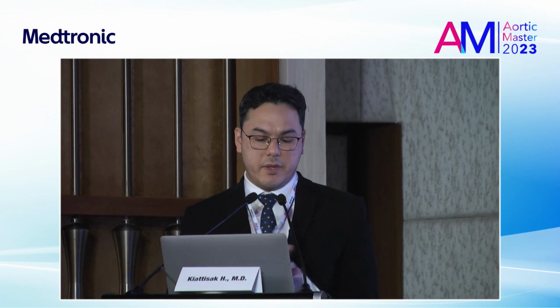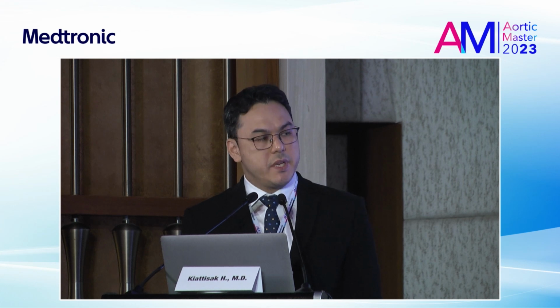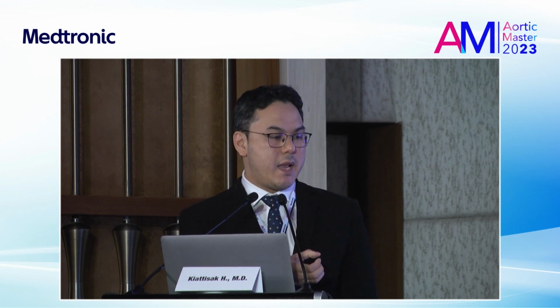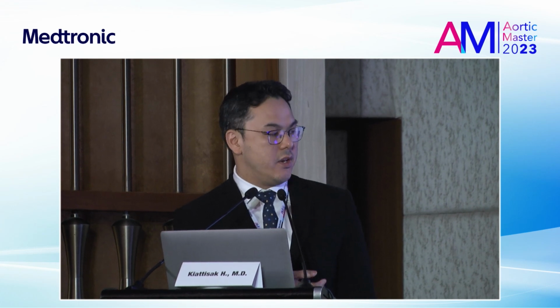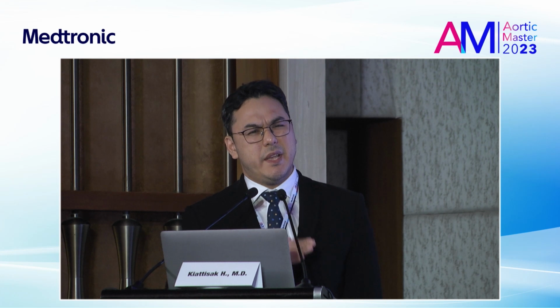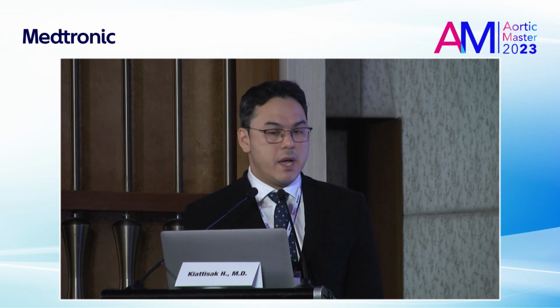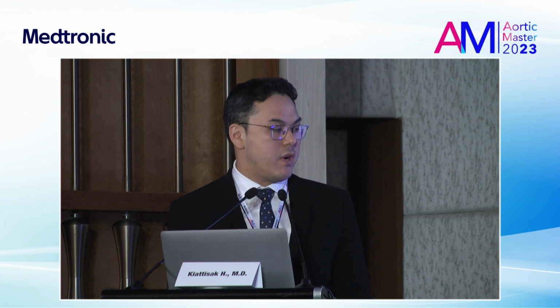I think when you face endotension, and most of them are hidden endoleaks, you have to look at everything for the patient. You have to look at the configuration of the stent, because sometimes it expands and doesn't contact the walls, but the endoleak isn't clearly seen on the CT scan. Probably sometimes it's just less sensitive. So I'm not reluctant to send the patient for diagnostic angiography.